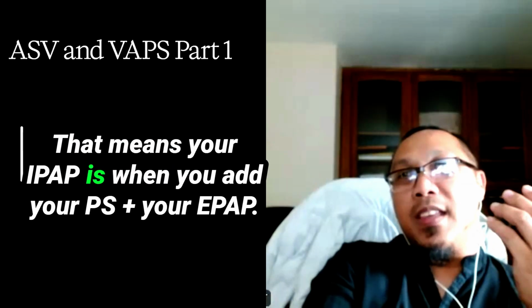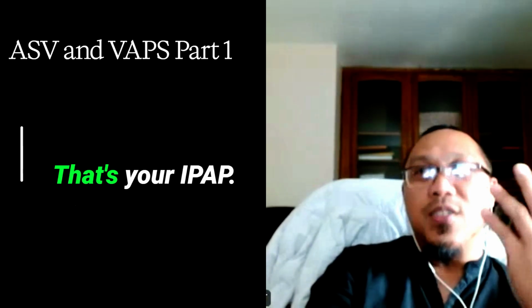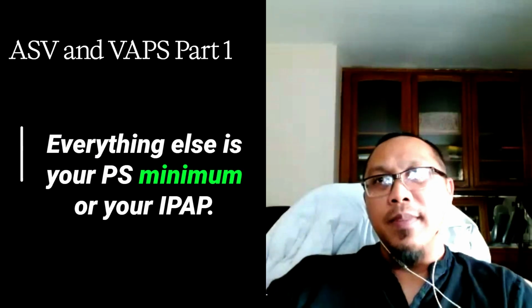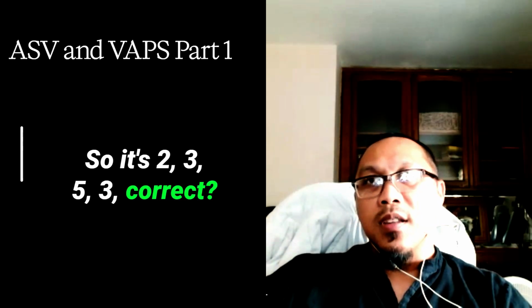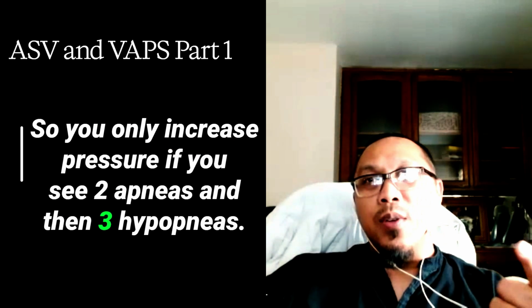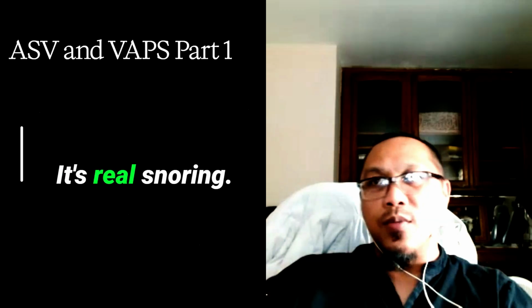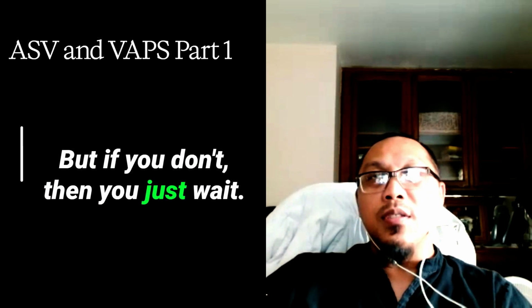That means when you add your pressure support plus your EPAP, that's your IPAP. We only increase the EPAP for OSA. Everything else is your pressure support minimum, or your IPAP. So it's 2, 3, 5, 3. You only increase pressure if you see 2 apneas, 3 hypopneas, 5 RERAs, and 3 minutes of unambiguous snoring, meaning it's constant snoring, it's real snoring. Then you increase your pressures. But if you don't, then you just wait.